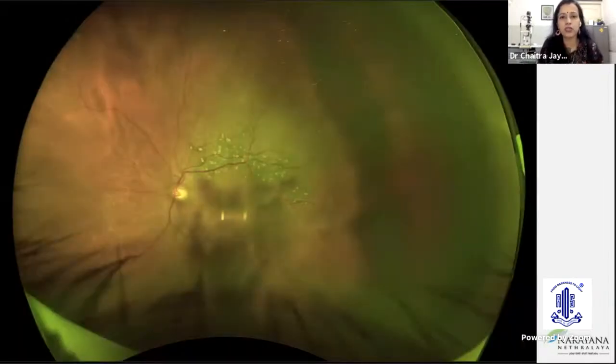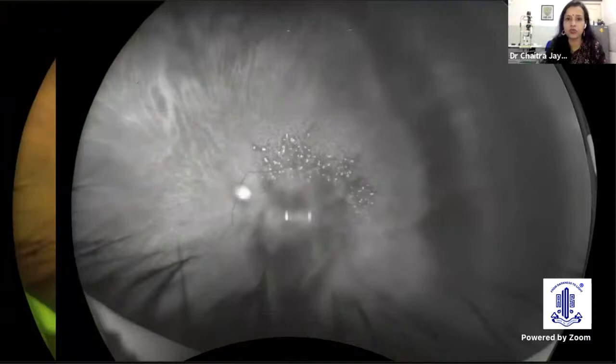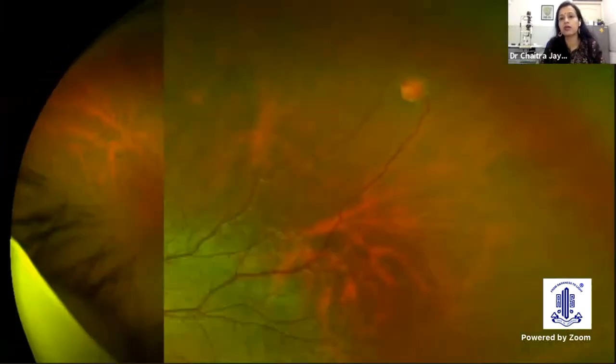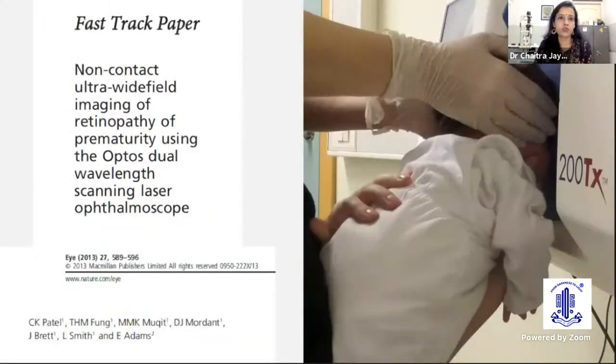This is, again, patients with secondaries we are able to pick up. And again, like I mentioned, FAF is a good tool here to delineate. These are, again, choroidal mets that we are able to pick up. This is, again, another patient where you can see the feeder vessel, very beautifully demonstrated for a VPT. Very useful in pediatric retinal diseases, especially because they do not cooperate. Those who have RetCam, well and good, but even ultra-widefield imaging helps with children. And medico-legal issues, sequential documentation, extremely useful.